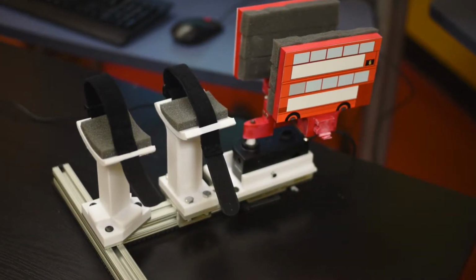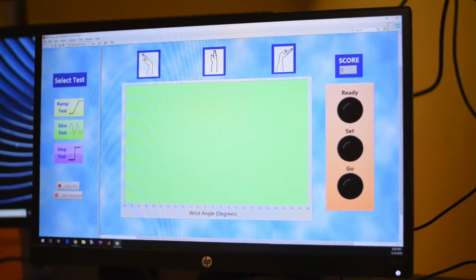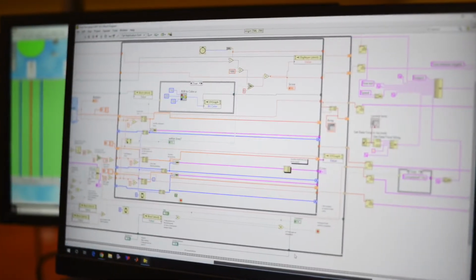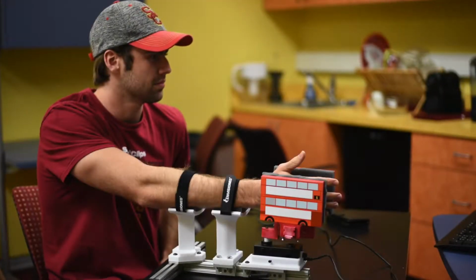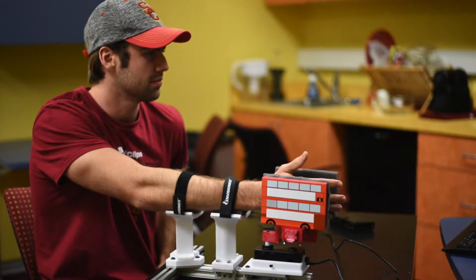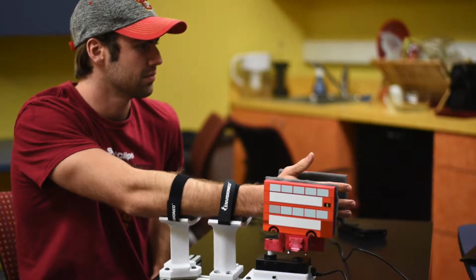Our device helps achieve this mission by providing a quantitative platform for the desired signal output as well as an adjustable and versatile hardware setup specifically designed for Sanger Lab patients. This device will be used in conjunction with patients who have electrodes placed in their brain to allow for the quantification of preferential neuronal activity for movement modalities.